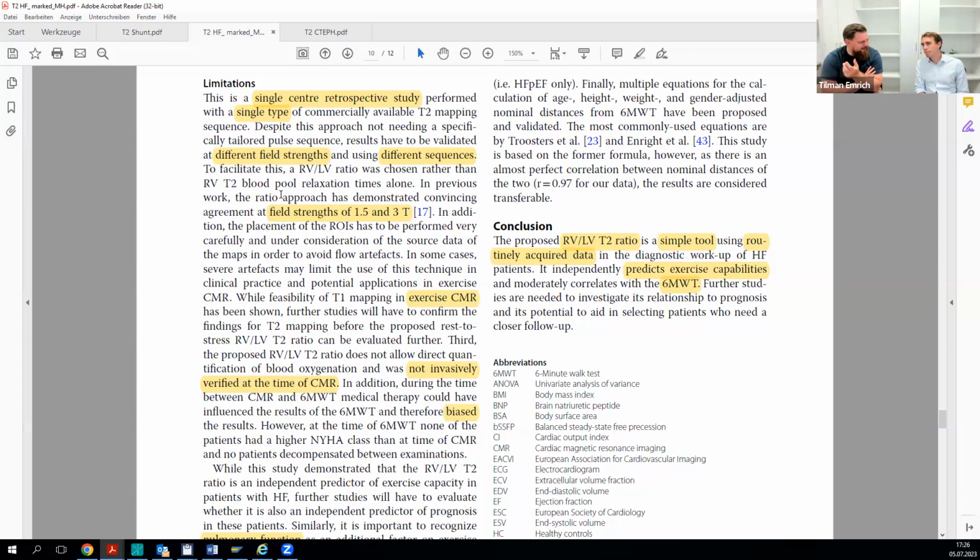Actually, we also ran the analysis post hoc on the short axis, and the results are super similar. So it doesn't change that much. In the first paper we published with short axis imaging, we did all the validation on short axis and long axis, and in the end, it doesn't matter. Do whatever you prefer. Also, a strict axial plane through the left and the right ventricle that shows both cavities would also work, right? So you just need a good look at both without prominent inflow artifacts or big artifacts, all that.